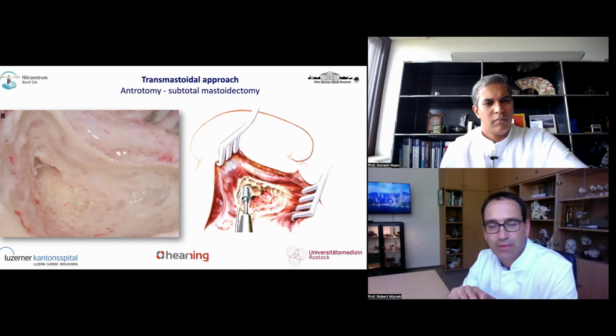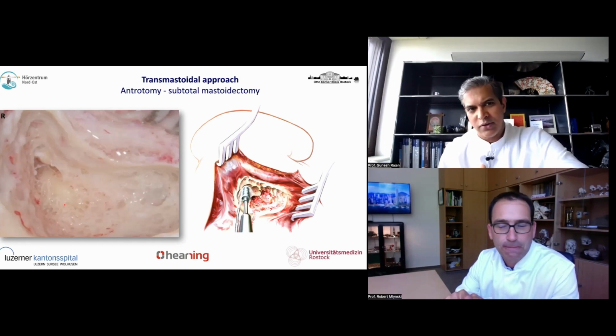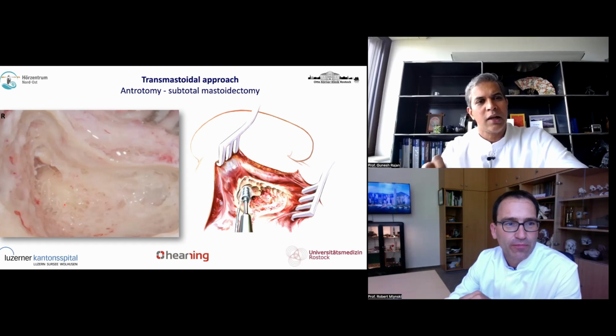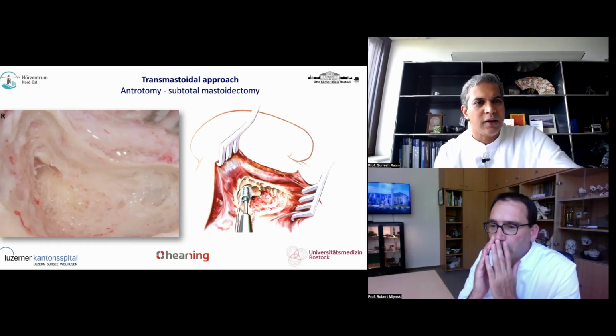One important point: if you're doing chronic ear disease, cholesteatoma surgery, I was taught to saucerize the mastoid bowl, but actually we don't want that in cochlear implant surgery, because we want some overhanging edges so that you can recess the lead from the coil to the implant to the array. That's a different kind of mindset when you come from chronic ear surgery.